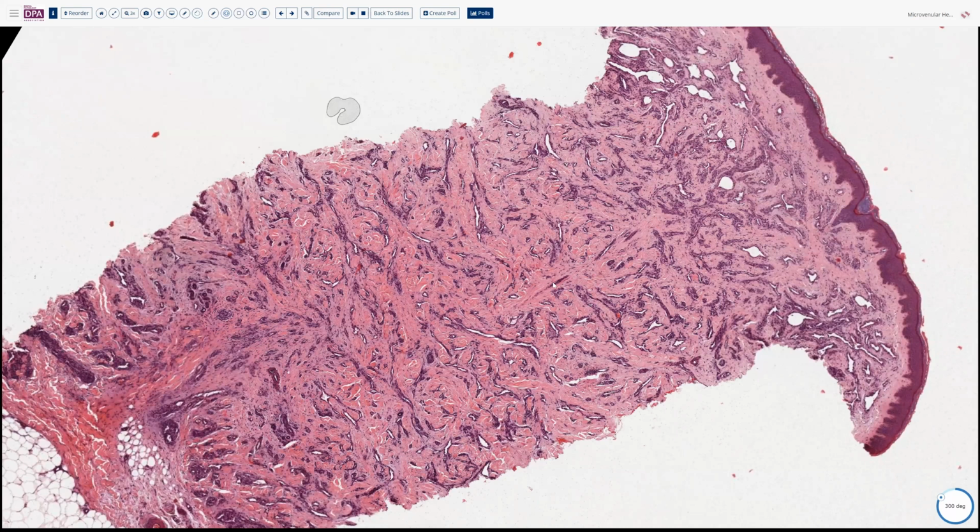And the dense fibrosis surrounding the vessels is, of course, very characteristic. The superficial dilatation of a few of these vessels can be seen fairly frequently in this lesion, but as you get deeper, they should all show this very compressed or slit-like pattern.